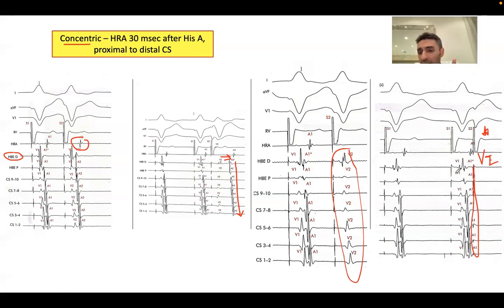Usually you see latency, meaning stim to V gets later and later and later, and eventually there is no ventricular capture. These are terms you need to know, retrograde VA block or ventricular ERP. You have to take note of all this and write them down, especially those not on the cart or inside, those Muhammad, Amal, and Saleh, you have to take note of these.